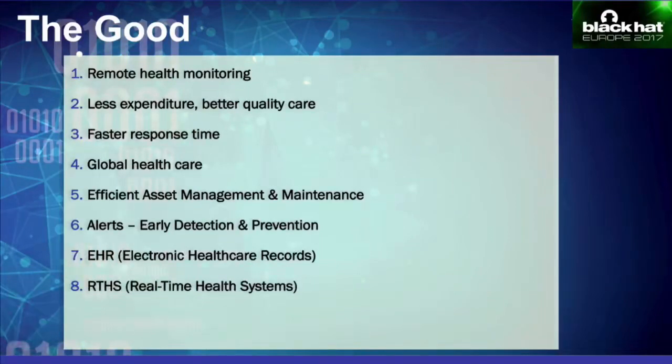Connected medical devices can also remind patients of taking medicine at a certain time, which could be a problem for some patients. And then finally, one of the most important, in my opinion, would be the EHR, which is electronic healthcare records systems and real-time health systems. These systems collect real-time data from all these connected medical devices.